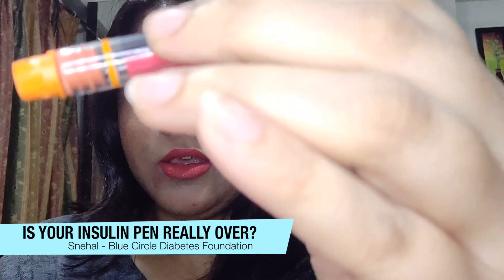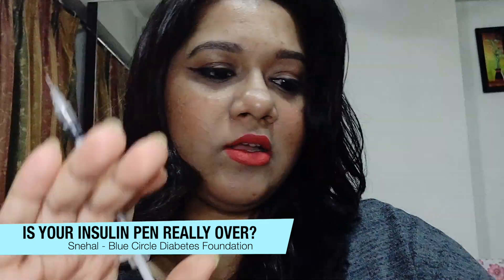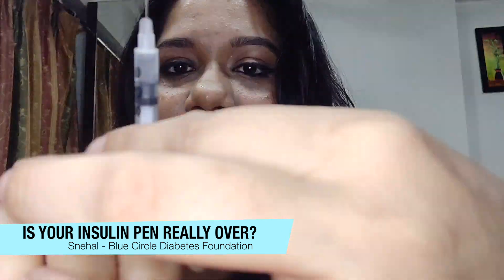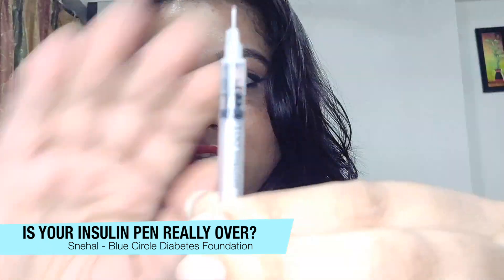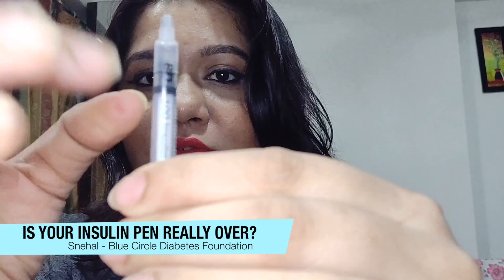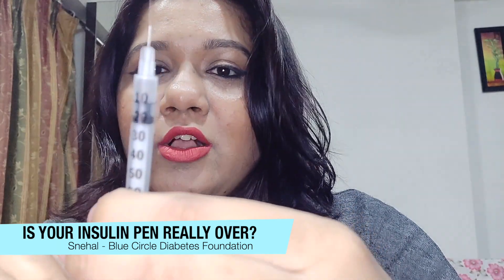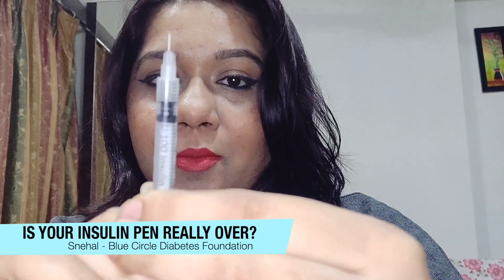Now you can see the cartridge is completely empty — there's no insulin left in it. When I look at my syringe, there are some air bubbles in it, so we'll take those out and see how much insulin we were able to get out of the cartridge that didn't seem to work in the pen.